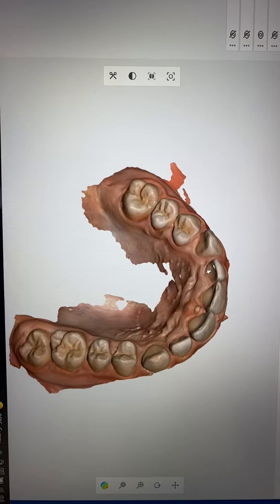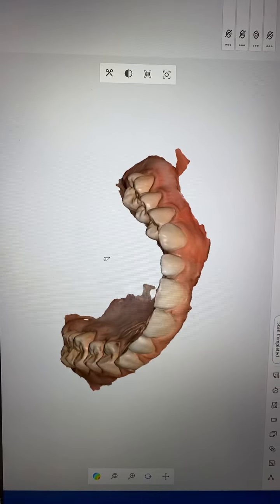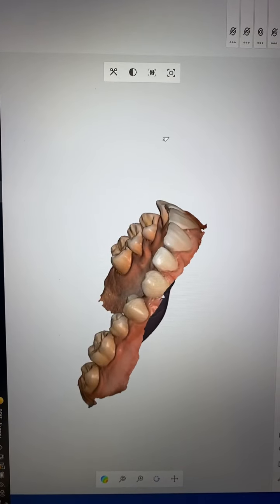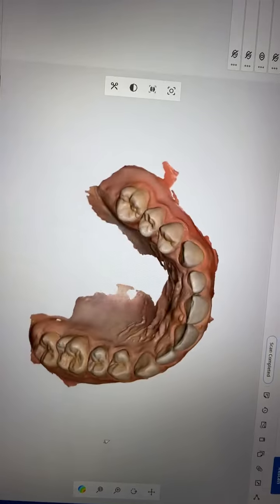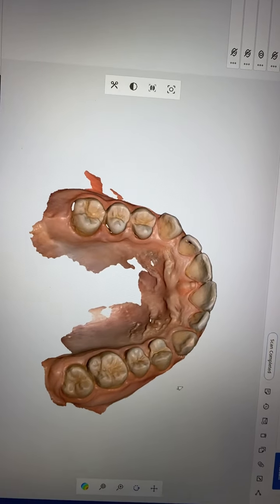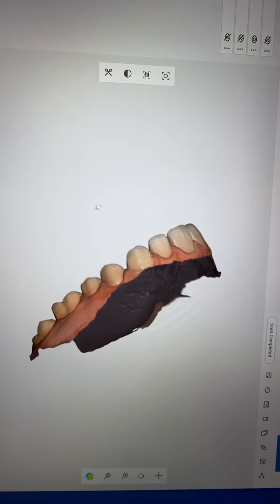As you can see, there is space between the premolar, canine, lateral incisor and central incisor. What's interesting is you can see that on this 17 year old, the upper number 6 canine looks pretty original. There is no wear and tear. But if you look at number 11, the cusp is gone.